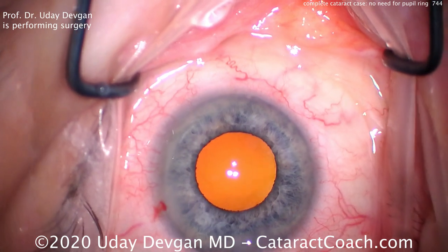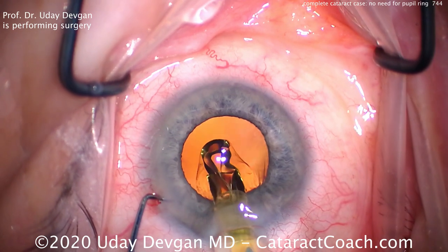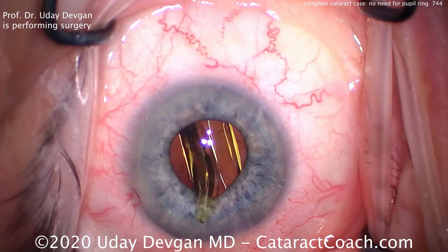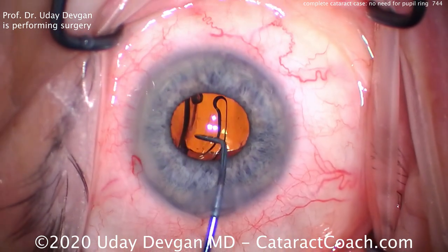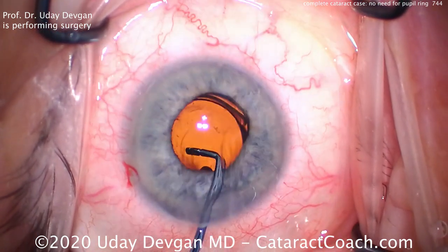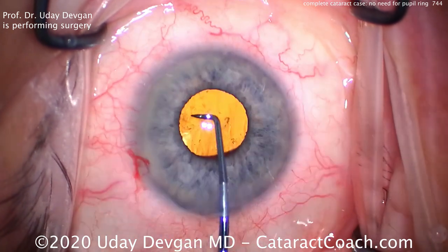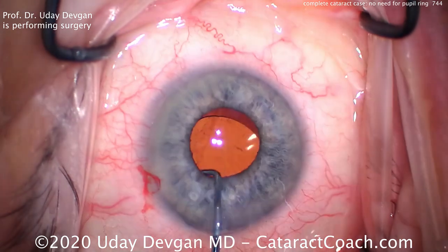Here comes the lens — we're going to implant the lens now. Lens is going right inside the capsular bag. Is it totally in the bag? We have to make sure. So we're going to place the chopper here and use that to dial in the trailing haptic before it opens up. We can center up the lens, make sure that haptic unfolds. Then we're going to use that chopper and lift the iris, and we can make sure that the lens is in the capsular bag behind the rhexis. We can also make sure there's no residual lens material or cortex hidden underneath that iris.